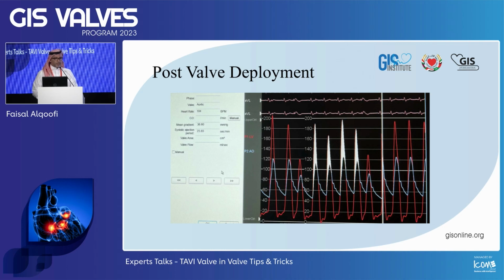That's an excellent point. And to your point, I did not do that because I thought the risk is still small, because even if we fracture, how much of the valve can move? But that's a very important point. And I think this is a dynamic process. If you thought about fracturing with a low-lying left main, you might end up protecting. But I can tell you in this case, we did not do it because of the false assurance that a LIMA to an LAD is functioning and filling retrograde very nicely in an 85-year-old guy.